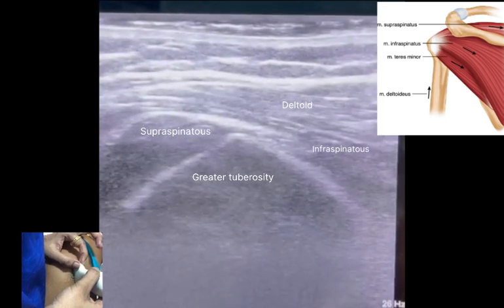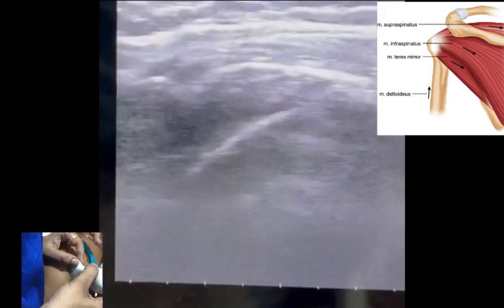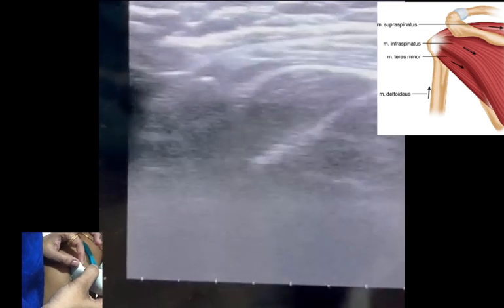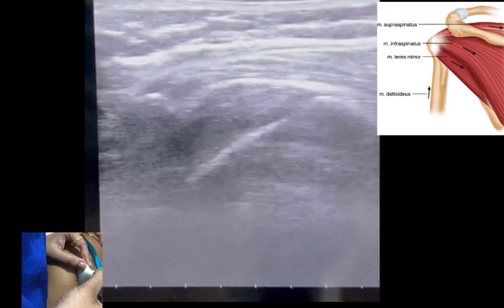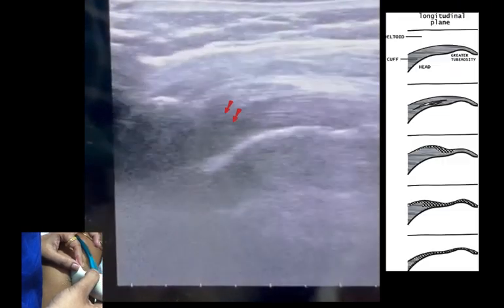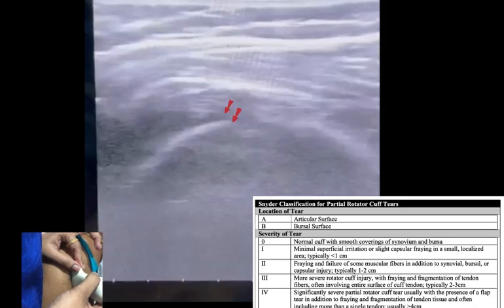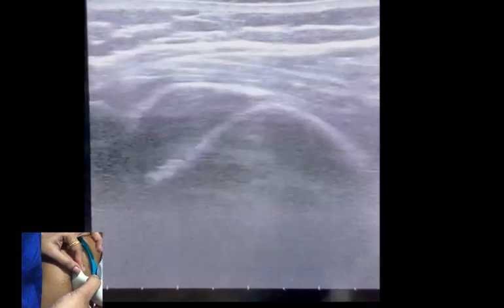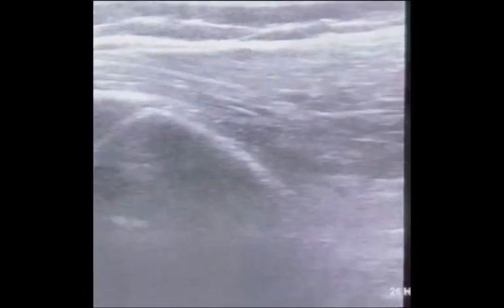Supraspinatus tendinopathy is when the pathology occurs anywhere over the tendon, while enthesopathy is when it occurs at the point of attachment over the bone. We can see a tear in the supraspinatus muscle. The arrow points towards the hypoechoic region, indicating fraying of muscle. We can see some inflammatory changes in the infraspinatus muscle as well. However, there was no tear.